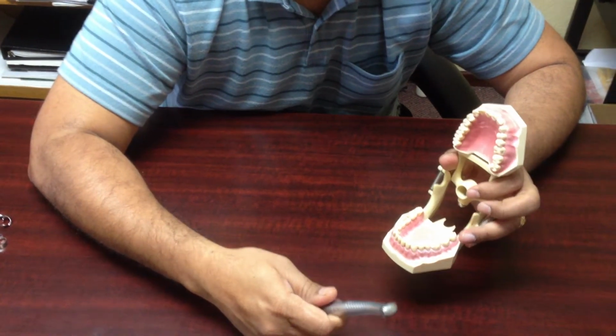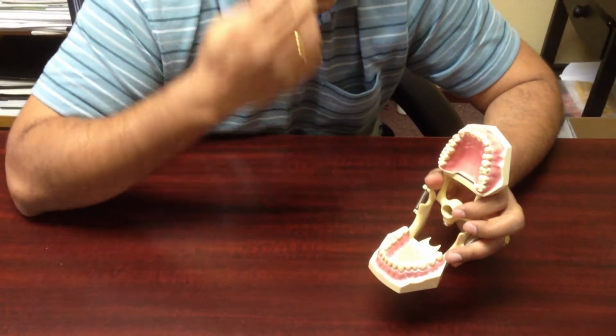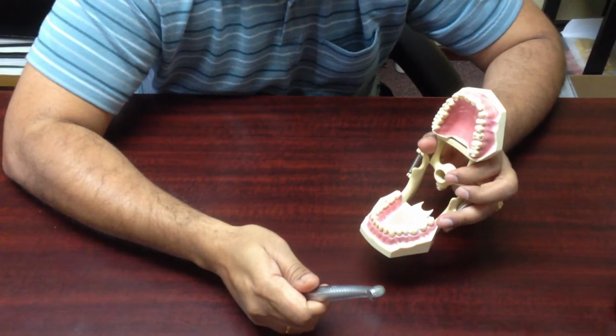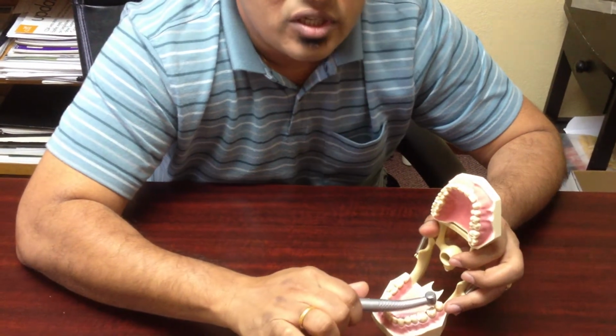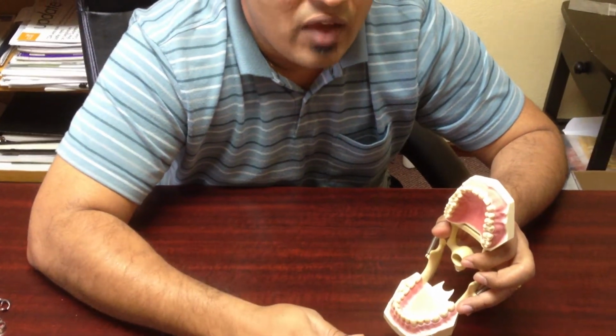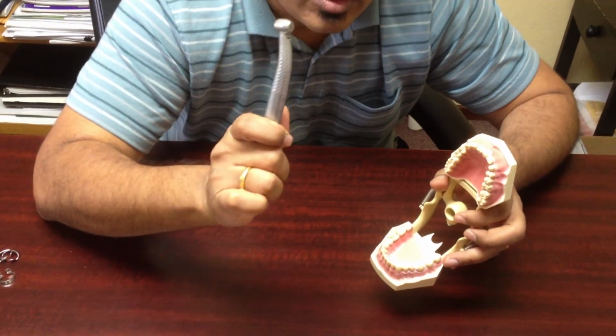All right. So now what I'm trying to recommend or suggest is a way to scan the tooth before it's even cut like this, when it's still in the intact phase. We know there's a cavity, and the drill will have a built-in camera scanner.